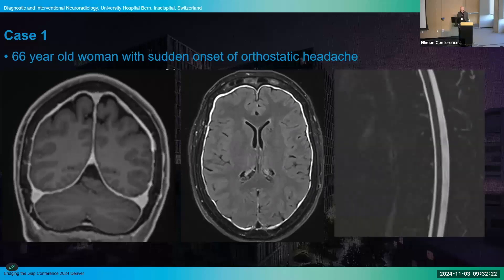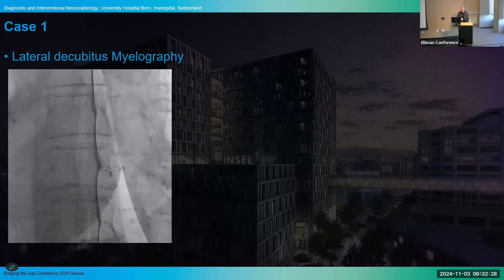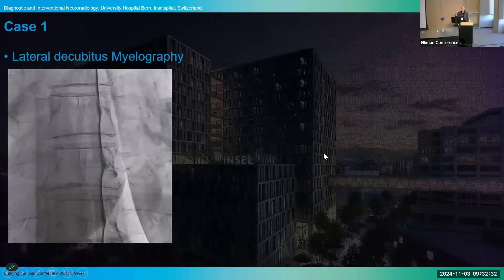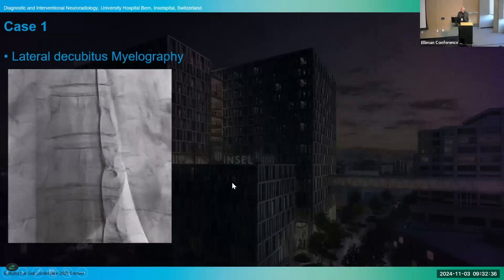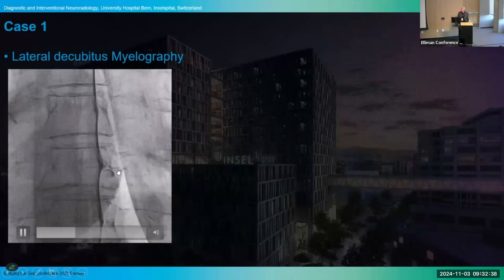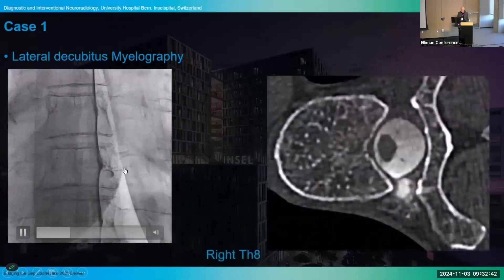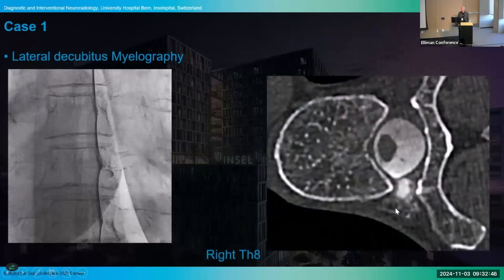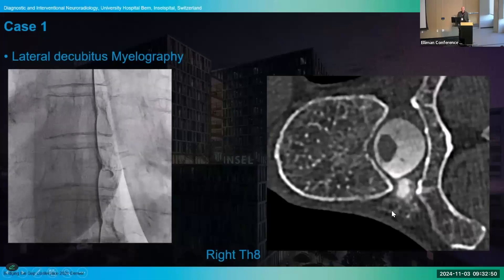Spinal MRI shows no epidural fluids, so we think about CSF venous fistula. We perform lateral decubitus myelography and keep the patient free breathing through all the inspiration and respiration cycles. Then you really see this small vein where the contrast media is flushing away. On CT you see the same — small paraspinal veins opacifying with contrast media. So this is a clear CSF venous fistula.